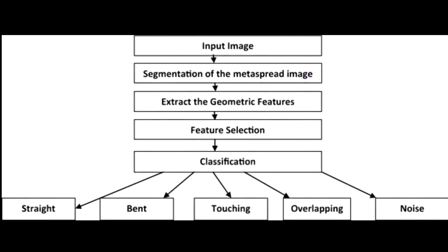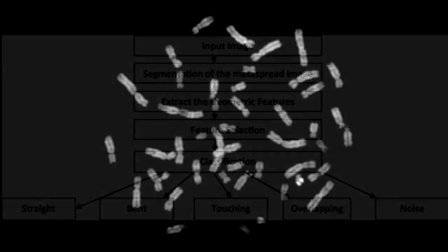This project deals with taking input images of the metaphase cycle of cell division, which contains highly condensed chromosomes, and then performing chromosome segmentation over these images, and finally classifying these chromosomes to generate the final karyotype.